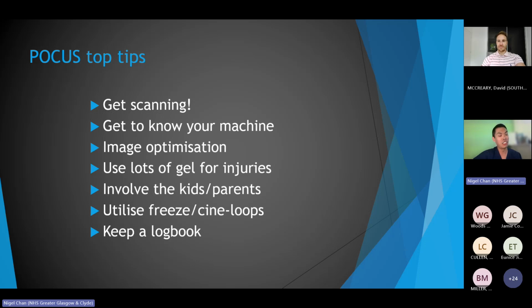Do it in your non-clinical times, do it when you're not on the shop floor, as an educational thing. Ultimately, it's a technical skill. You can read as much as you want about how to put in a cannula, but until you actually pick one up and do it, you need to get a feel for it. And it's the same with doing ultrasound. You need to get a feel of how to hold the probe properly, how to get the best quality picture you can get, because ultimately, if you've got poor information, you can't really interpret it very well.